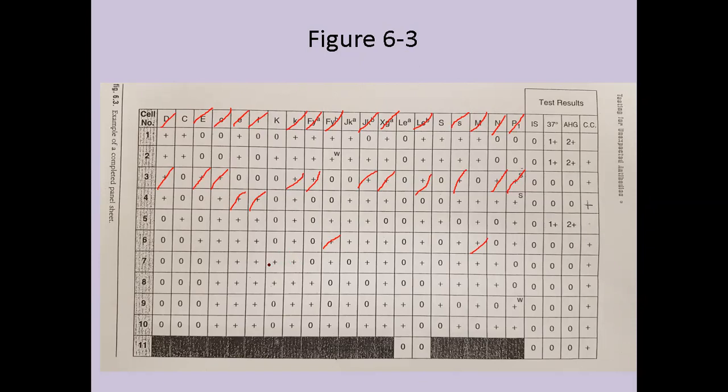And so the KEL antigens, when we're trying to eliminate big K, we don't have to necessarily look for a cell that doesn't have little k because it's going to be very hard to find. So usually we don't apply those dosage rules that we do with other antigen systems when we're talking about the big K. So we're going to eliminate that one even though it's heterozygous because our textbook says we can. All right. So we're going to get rid of the big K. We can't do anything with JKA, nor LEA, nor big S. All right.